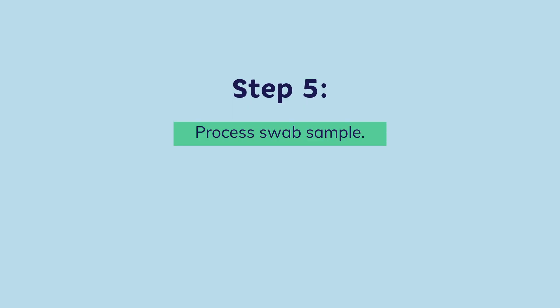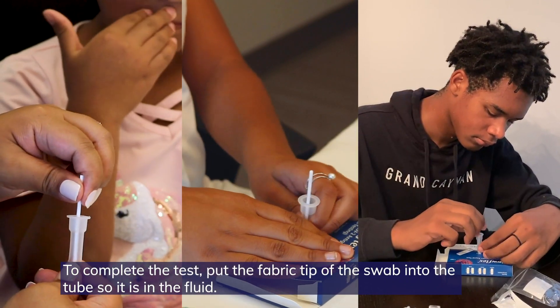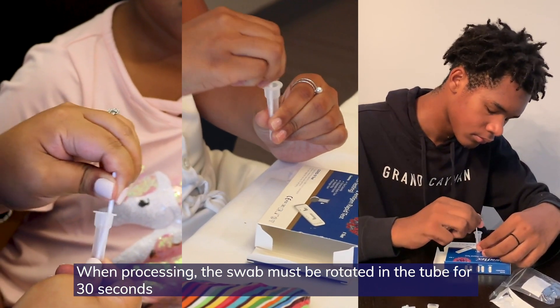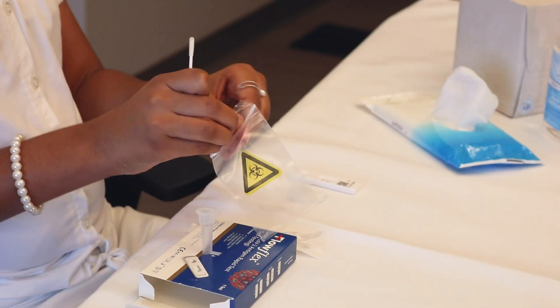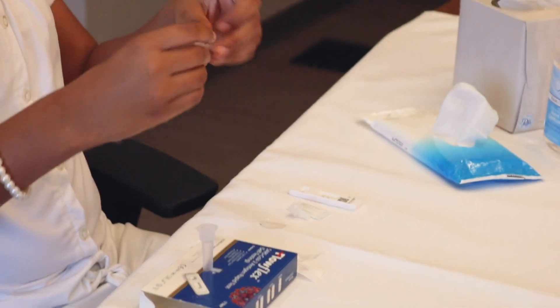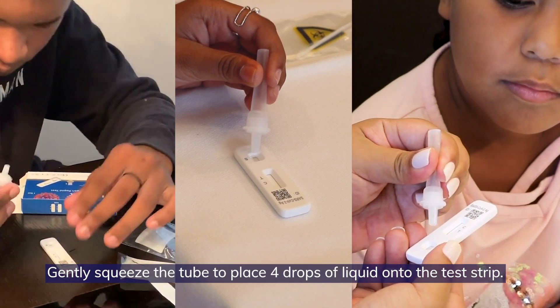Step 5. To complete the test, put the fabric tip of the swab into the tube so it's in the fluid. The swab must be rotated in the tube for 30 seconds, then rotate it five times while squeezing the side of the tube. Place the swab into the plastic waste bag. Gently squeeze the tube to place four drops of liquid onto the test strip.